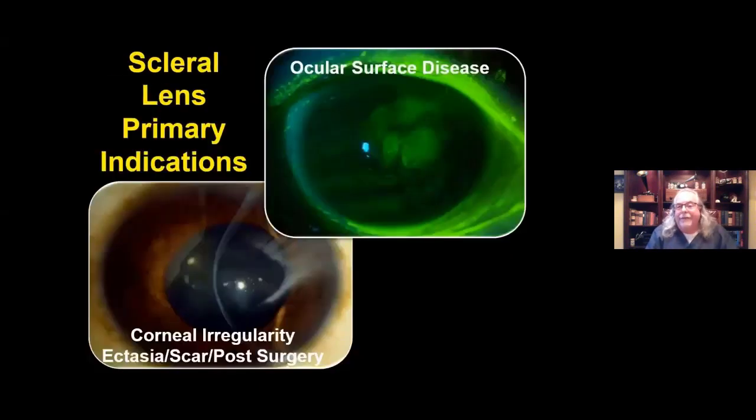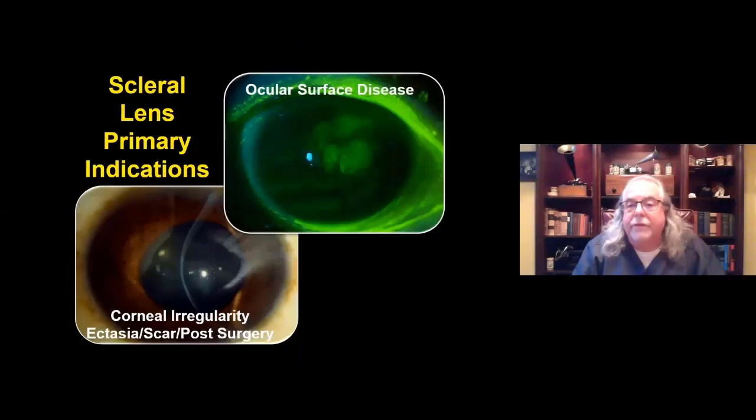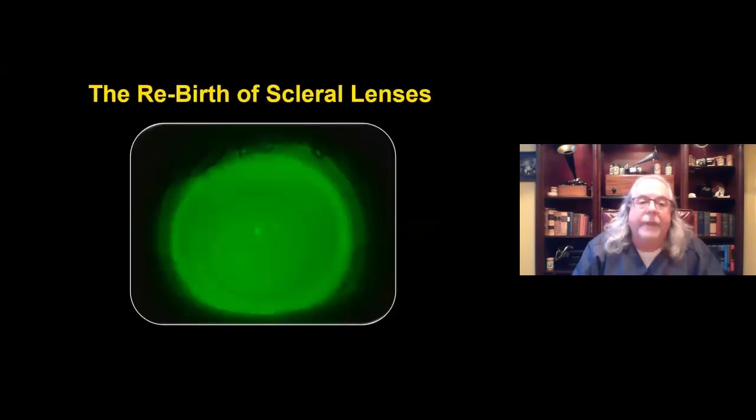As we know, these lenses have had a pretty dramatic impact on our contact lens practices, in our normal practices. They've been used predominantly in two situations, ocular disease and the correction of irregular astigmatisms. Irregular astigmatisms when we can't get a corneal contact lens to perform well.